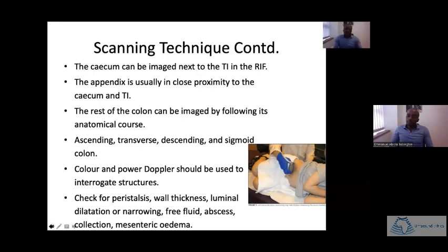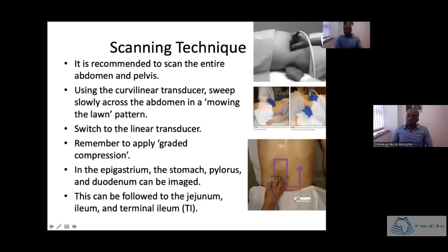That's partly because you're sitting on the right side of the patient here. So you want to get the distal-most part, the part that's away from you, first, and then you can follow that course slowly until it comes closer to you. That way you're working your shoulder less, and you don't lose muscle tone when you get to the other end. Instead, you're coming closer to you, so it's easier and you're able to focus more on the scanning.